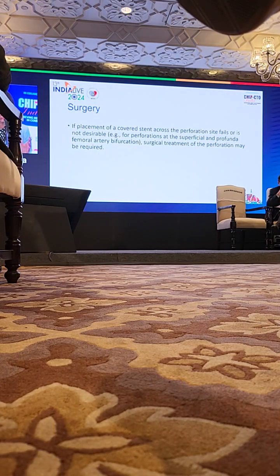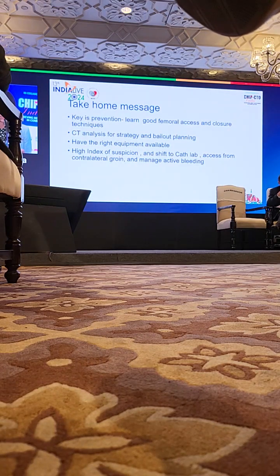But mind you, it doesn't work in most of the patients because they are fully anticoagulated and nobody wants to work on these patients. So my take-home message from this talk is that the key is prevention. We all should learn good femoral access and closure techniques. And if you are doing a TAVR CT analysis, look at it yourself, choose your site carefully and have a bailout plan. Have the right equipment available and know your stuff.